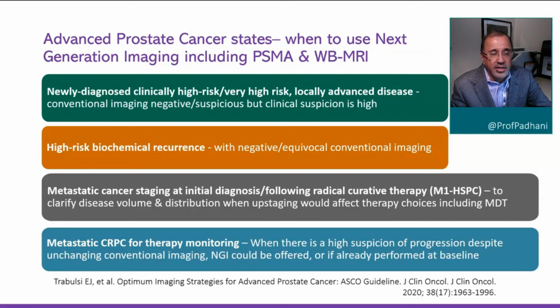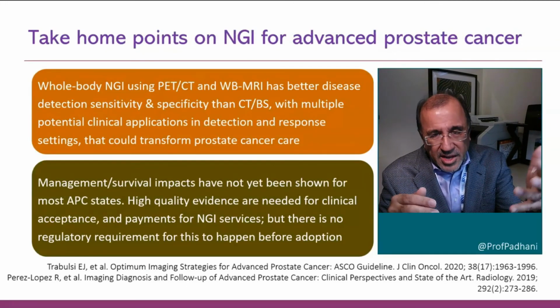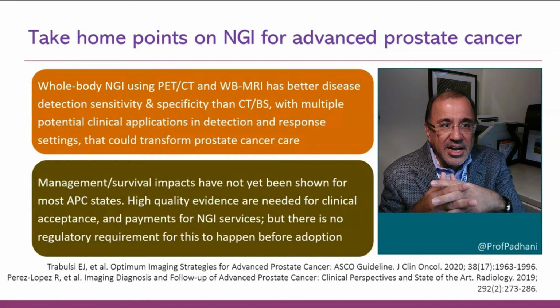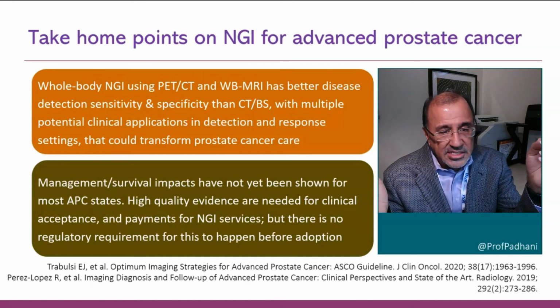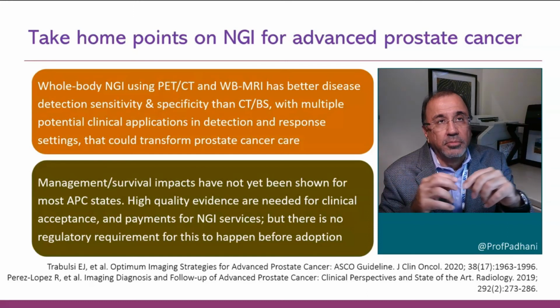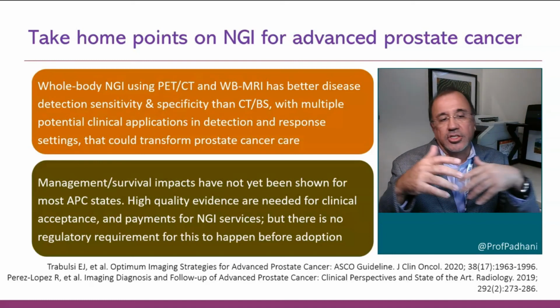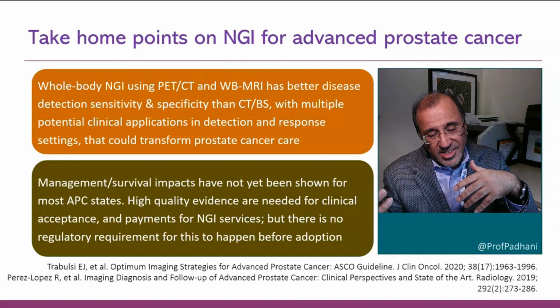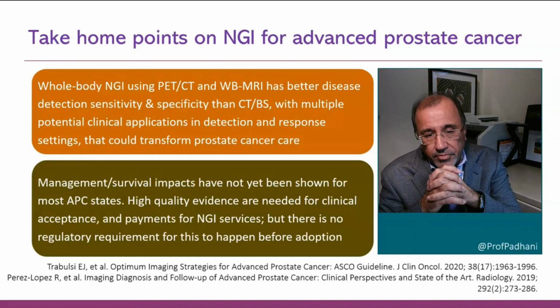next-generation imaging for that. So here are my concluding remarks. Next generation imaging technologies with PET and whole body MRI undoubtedly increase detection sensitivity and specificity compared to bone scans and CT scans, with multiple potential clinical applications related to detection and response assessments that could transform clinical care.